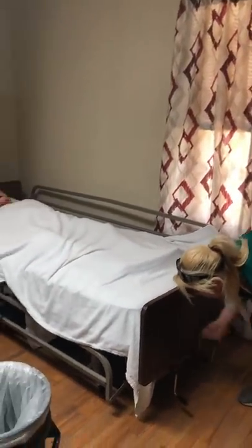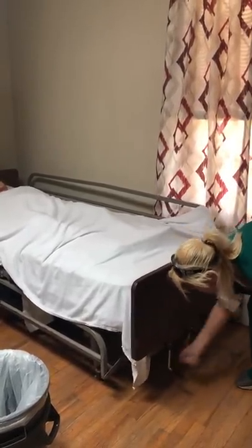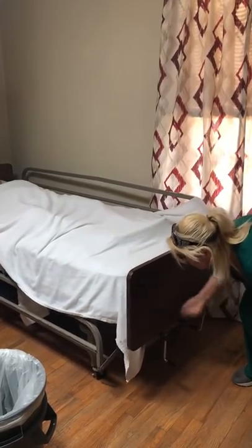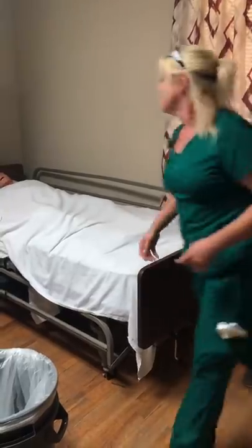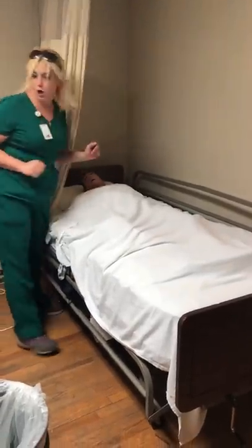I'm going to put this bed up to a good working height, which is mid-thigh to waist level. We've pulled our privacy curtain — I won't pull it too far because I want you to be able to watch.